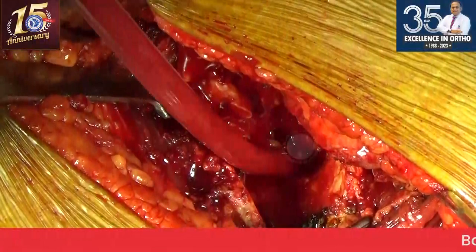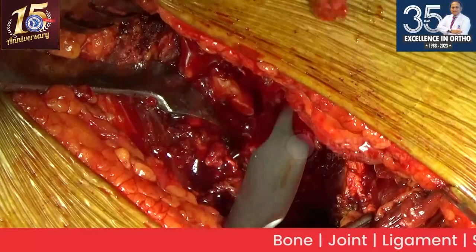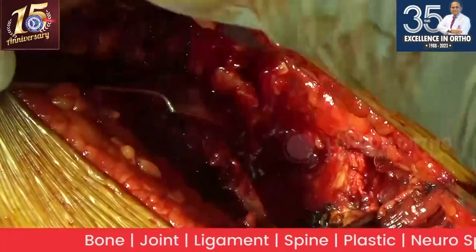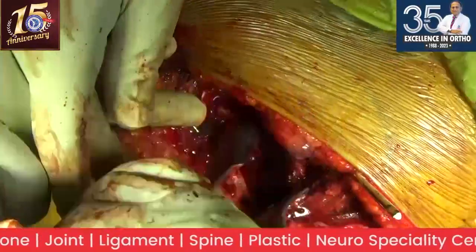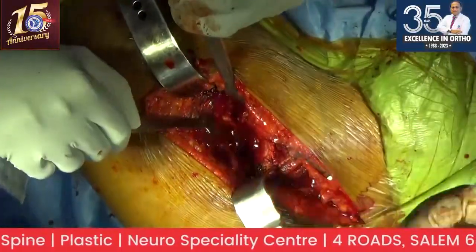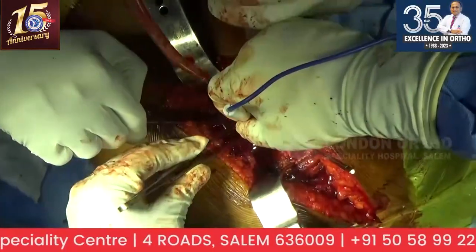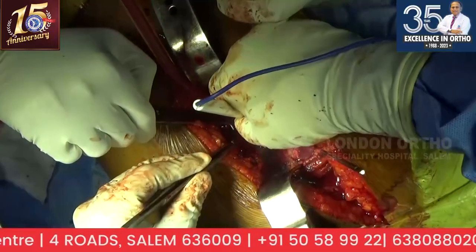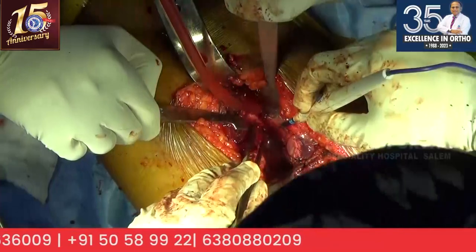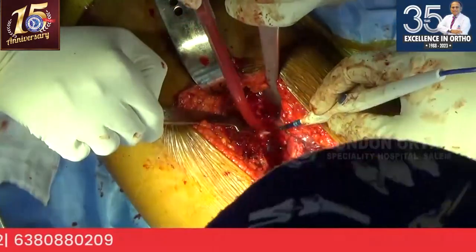Yeah, release the rectus, retract part of the rectus from the anterior inferior spine and release the rectus, and yeah, that's it. Put like that? Yeah, put a Hohmann, that's it. Especially at the 11 o'clock position. That will be safer for the femoral nerve. Sure, thanks. And obviously, it's a much bigger incision, more extensive exposure than for a regular case. So that's the tail.